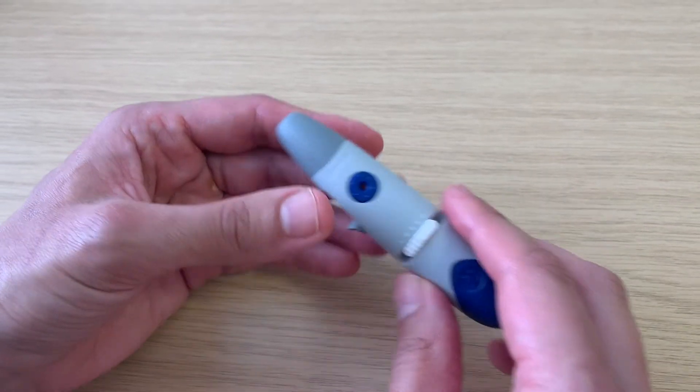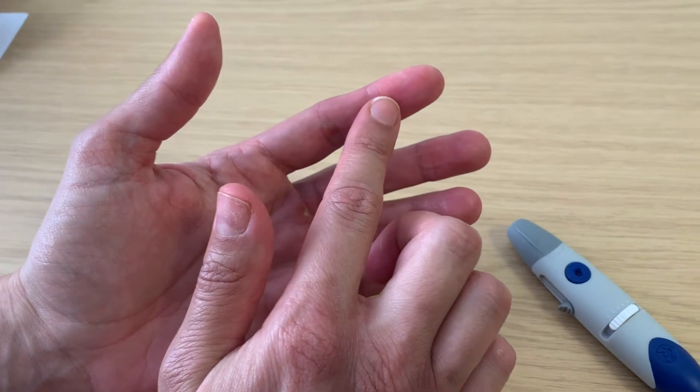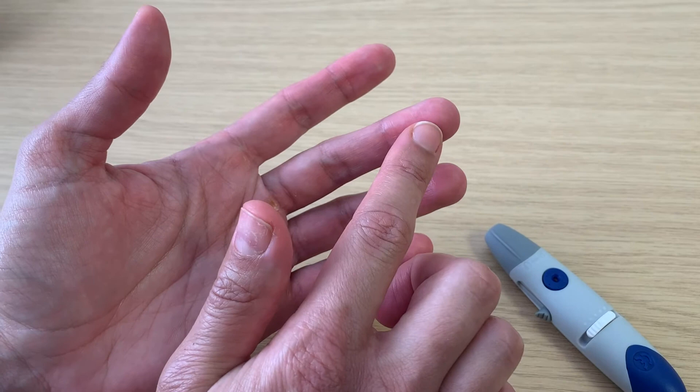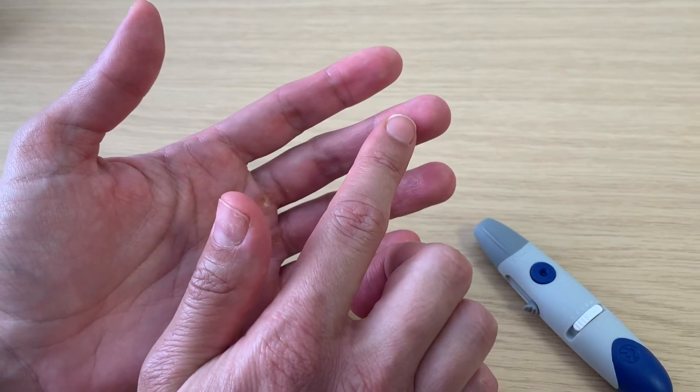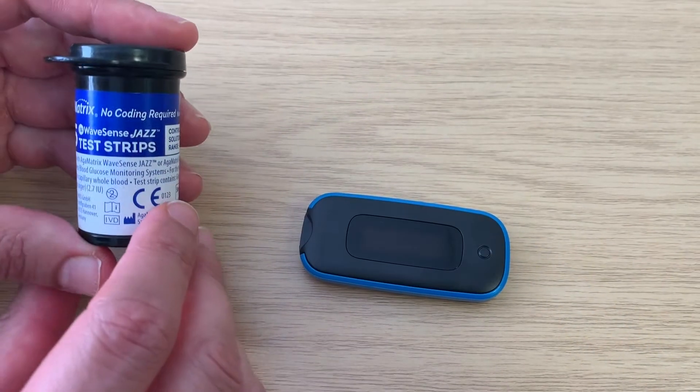You can take blood from any finger. Try to rotate and avoid overuse of the thumb and index finger. Also avoid the pads of your fingers, because these contain the most nerve endings and can be the most painful. Ideally prick the finger slightly to the side.